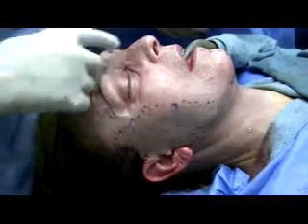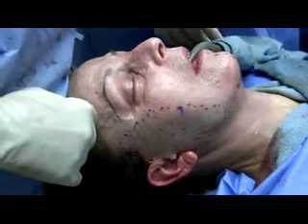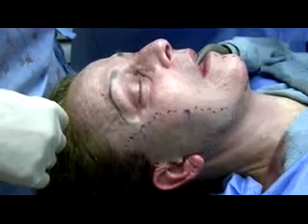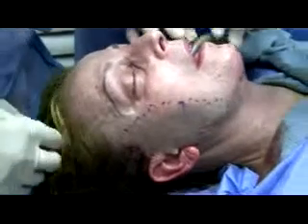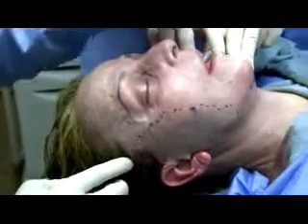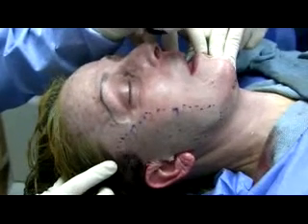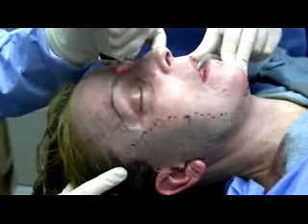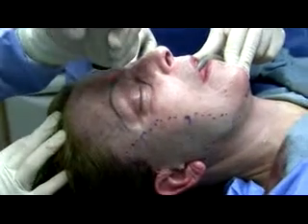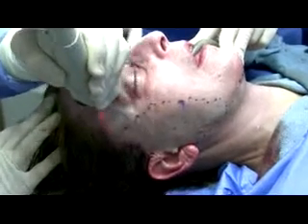This lady has a lot of actinic damage, so we're probably going to use this is the Lumenis Encore CO2 UltraPulse laser. We're using the fully ablative mode, and we're going to do a pretty aggressive treatment here, 100 millijoules in a density of 6. So we're going to start by just going right up the midline. We frequently will have our anesthesia personnel go to room air instead of oxygen at this point. We have tattooed eyebrows here, so we have to be a little careful.